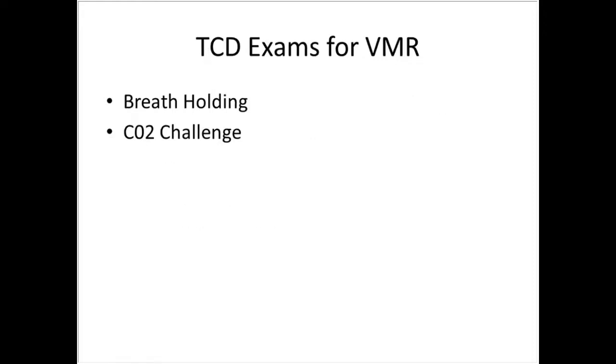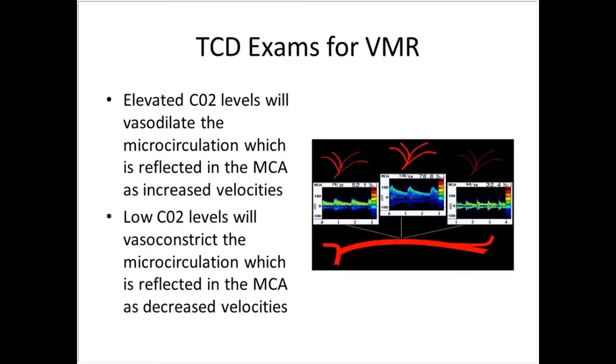I'm going to focus on breath-holding exams and CO2 challenge tests. To understand how we can use TCD to test vasomotor reactivity, you need to understand that when CO2 levels increase, it vasodilates the microcirculation, which then is reflected in the intracranial vessels, the major intracranial vessels here.